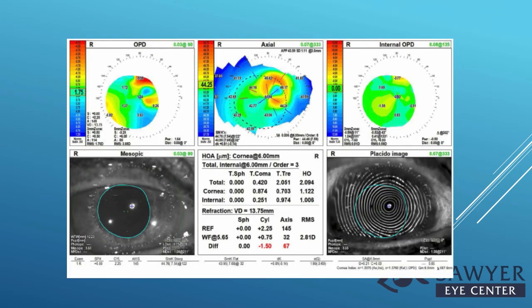This is her topography in the right eye. And if you look at that central top slide, that's the central topography. The arcs are centered at 5 mm, and it's given her this odd appearance with this flat bow tie at about 30 degrees, and then two circles that combine at the middle to give her a figure-8 cornea. Just a very odd appearance and a very difficult cornea to toric plan.